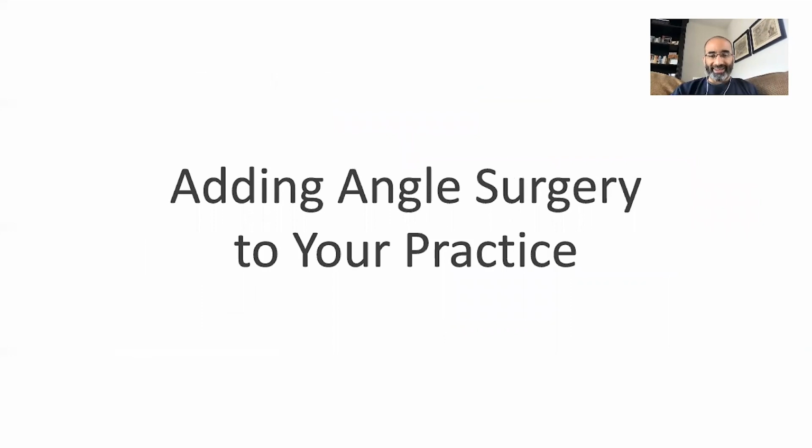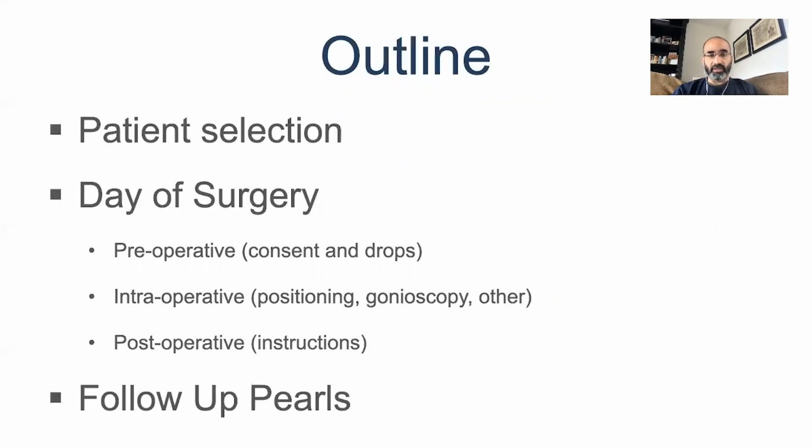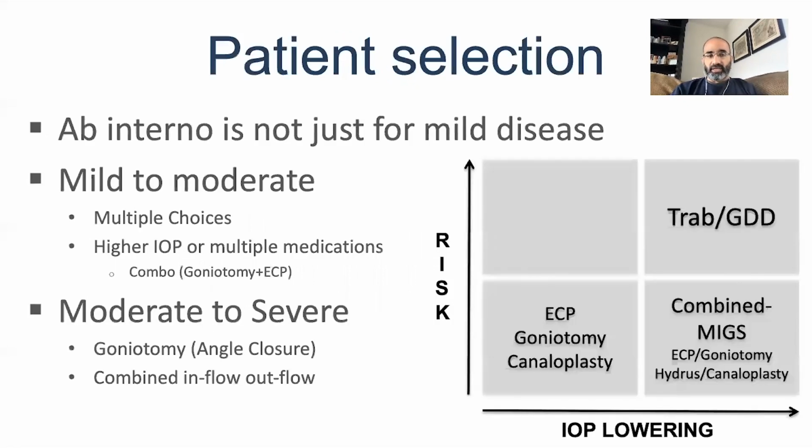What about adding angle surgery to your practice? If you're thinking about starting angle surgery, what are some of the things that you should be aware of from a patient selection standpoint, day of surgery, pre-op, intra-op, and post-operatively, and then some follow-up pearls that I'll share with you. One thing that I always like to say is that angle procedure is not just intended for mild to moderate disease combined with cataract surgery, which is how we usually see it defined.